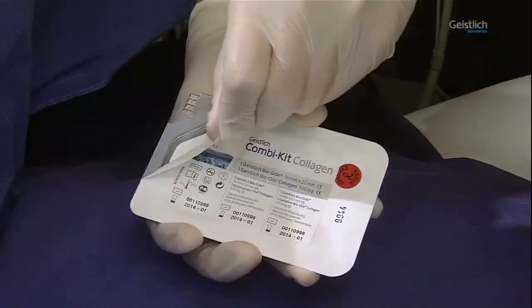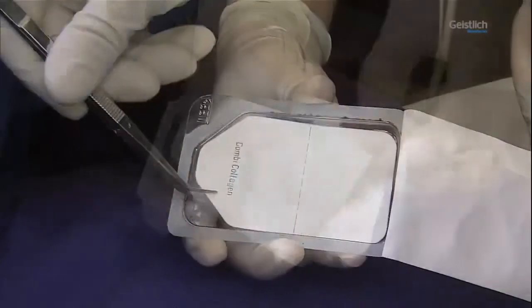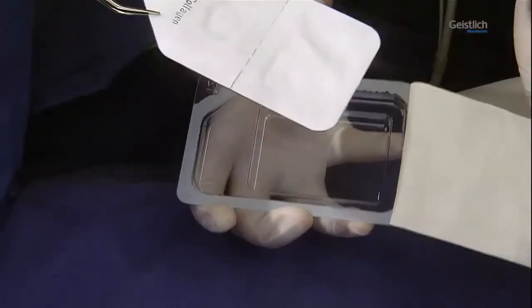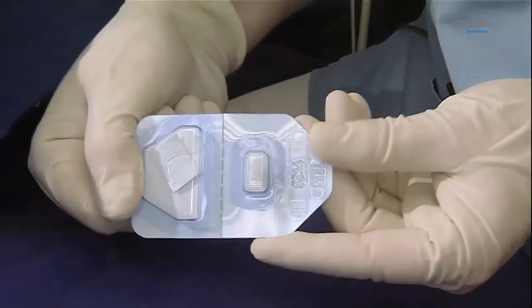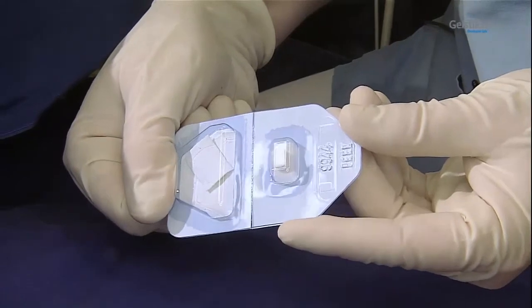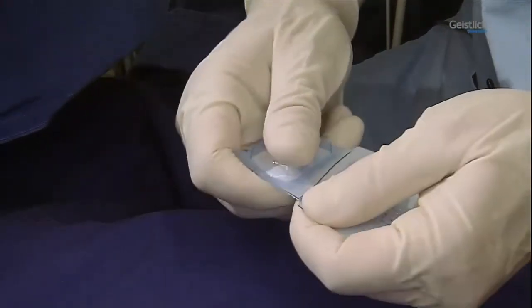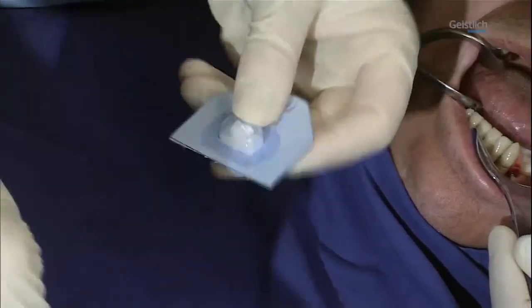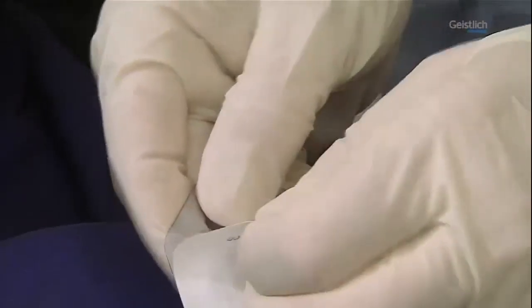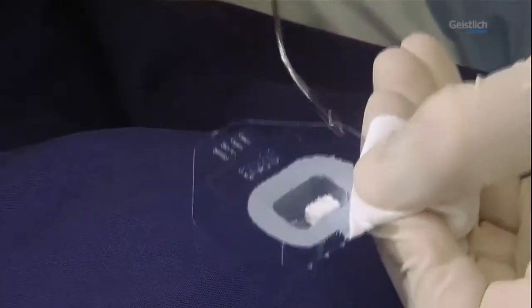The ridge defect is built up with bone substitute material. The Geistlich Bio-Oss Collagen protects the site from resorption on the buccal side. The Geistlich Combi-Kit Collagen consists of a 16 x 22 mm Geistlich Bio-Gide collagen membrane and a 100 mg Geistlich Bio-Oss Collagen block, which are individually packaged in sterile blisters. Both products should be used together in the same procedure.